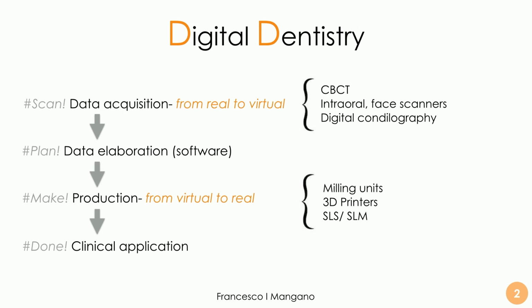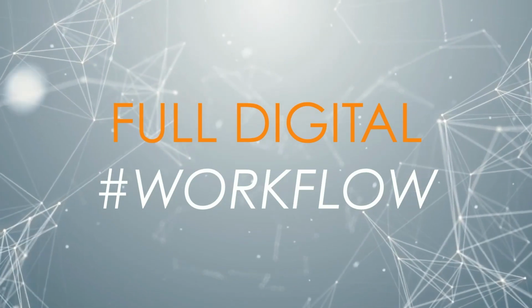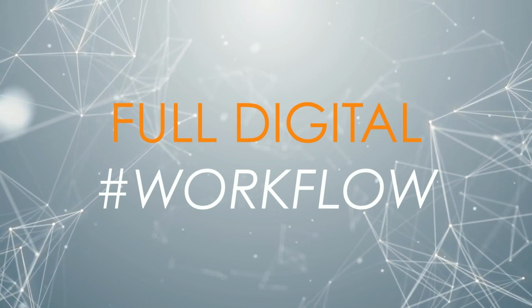Is the making phase. By means of milling unit, 3D printer, SLS, SLM technology, we can basically produce everything, and then we can clinically apply what we have produced. We can complete the workflow with the delivery of the surgical guide, the prosthetic restorations, the orthodontic device. Let's talk about a simple case treated through a full digital workflow.